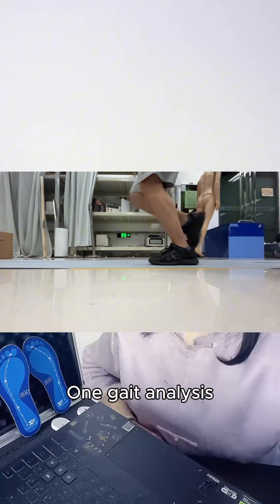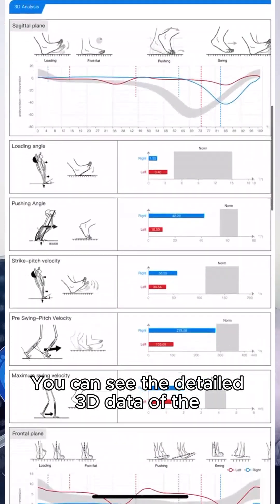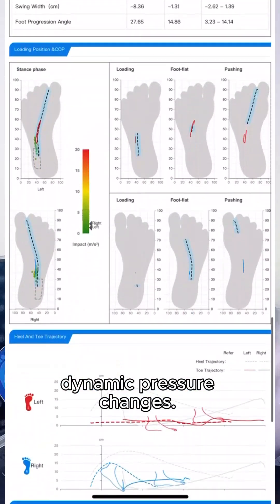One gait analysis with our system can generate more than 300 parameters. You can see the detailed 3D data of the feet in the report, and there's also the COP motion trajectory to capture dynamic pressure changes.